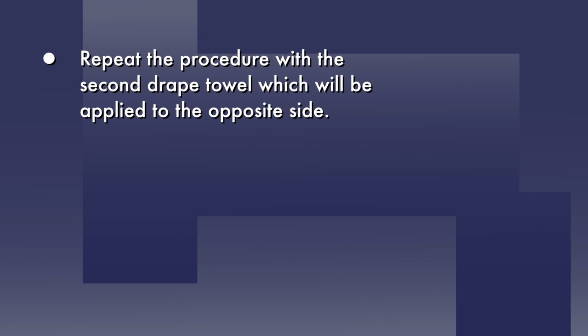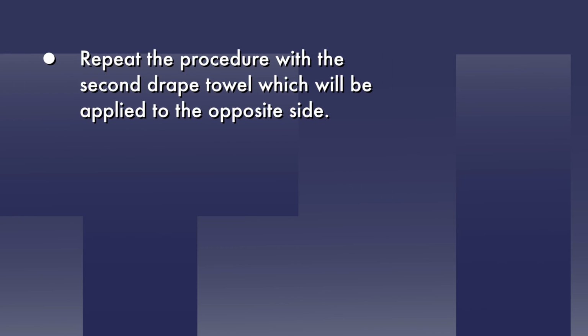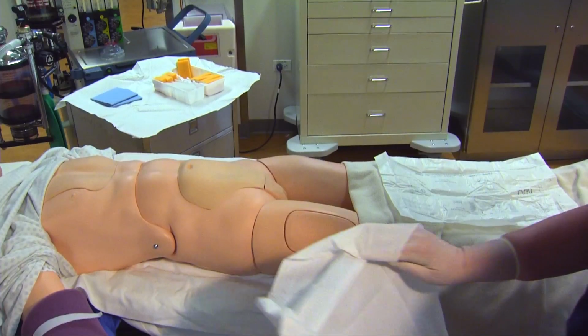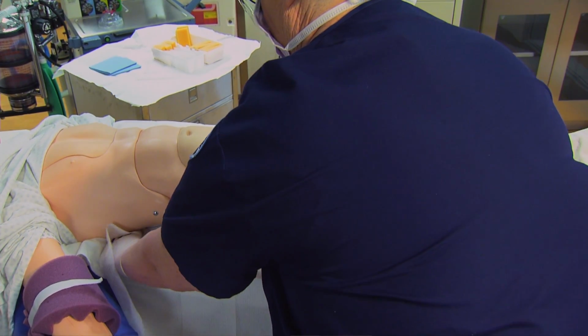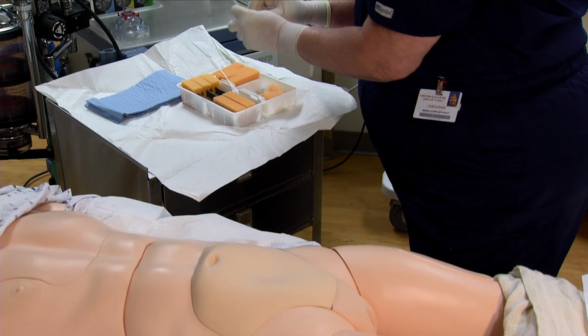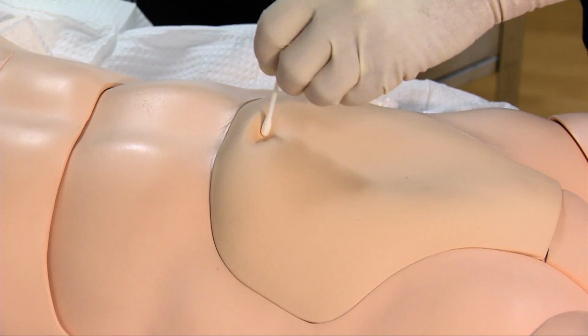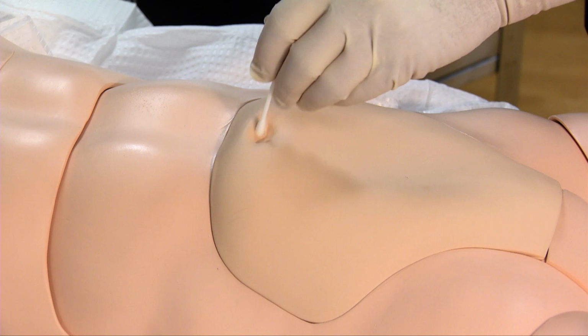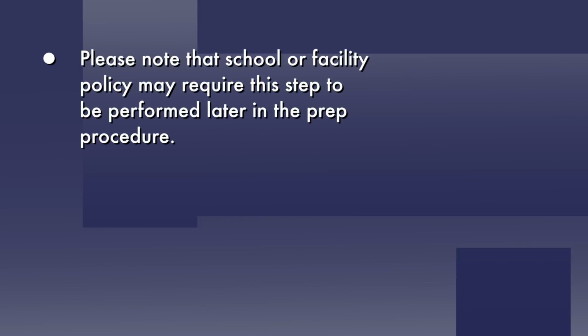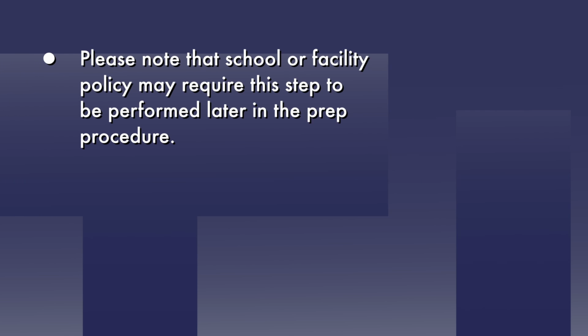Repeat the procedure with the second drape towel, which will be applied to the opposite side. It will be necessary for you to walk around the table to apply the distal drape. Dip the cotton-tipped applicator in the prep solution, transfer it to your dominant hand, and clean the detritus from the umbilicus. Discard the applicator after use and repeat as needed. Please note that school or facility policy may require this step to be performed later in the prep procedure.